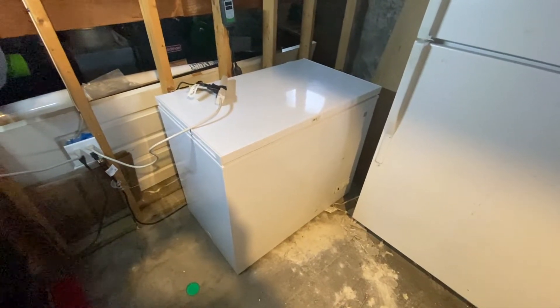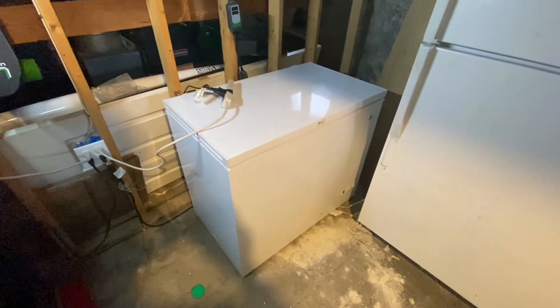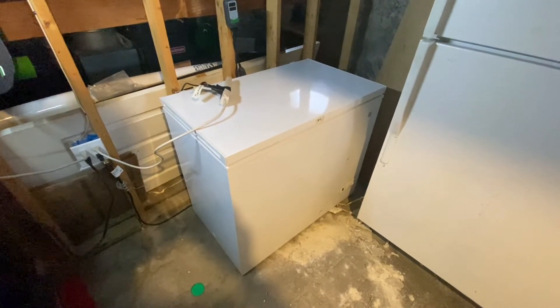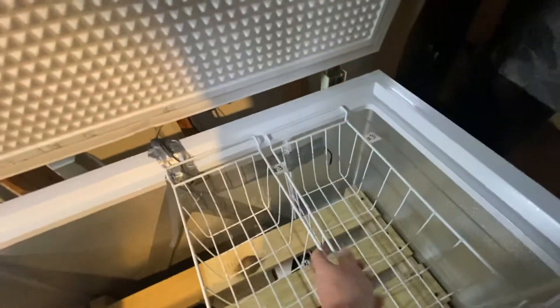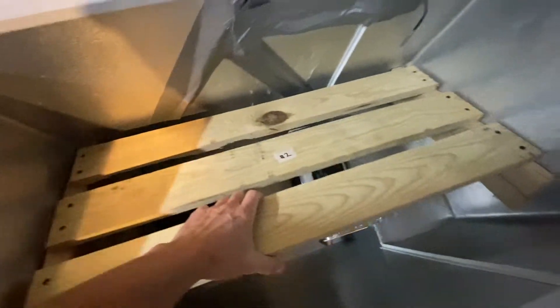So this is my homemade DIY heat autoclave for reusing N95s and sterilizing them. It's a chest freezer, and inside of it there are standard racks which hold things to be sterilized, and a wooden rack.